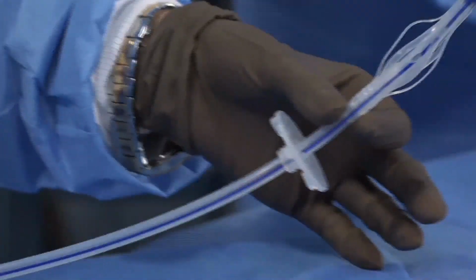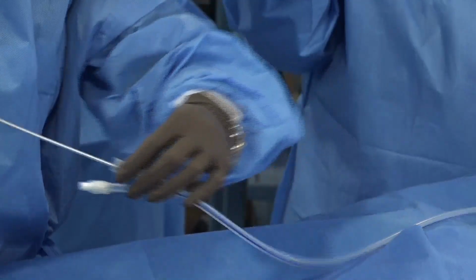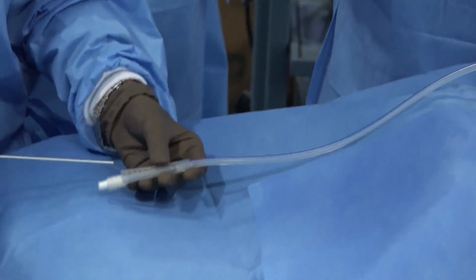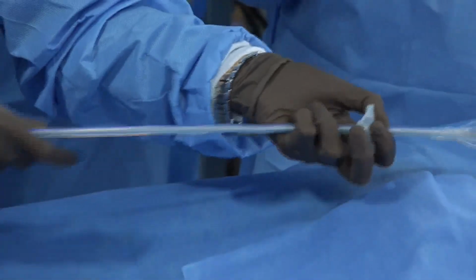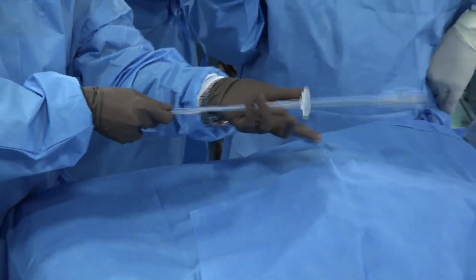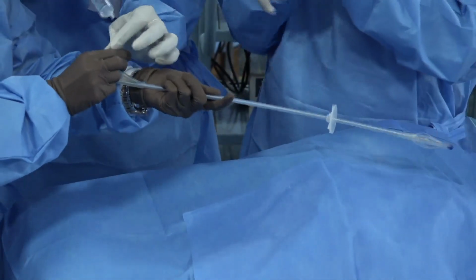So that is the catheter, all right? And this is the flange. So you introduce it, and there is an introducer. It's just like a Foley's catheter, and then we have this introducer, so it becomes rigid. So we put it inside through the cecum. It goes into the terminal ileum, howsoever long it needs to go. And once you have adjusted, then we inflate the balloon, just like a Foley's catheter.